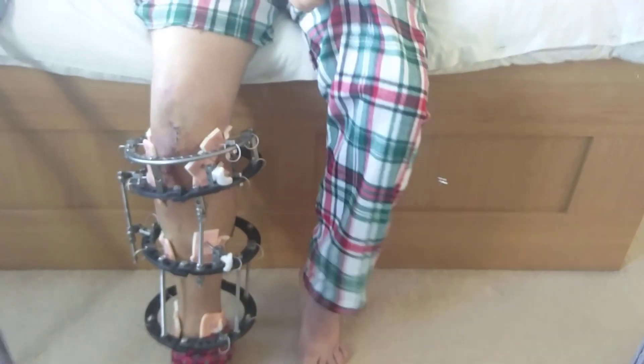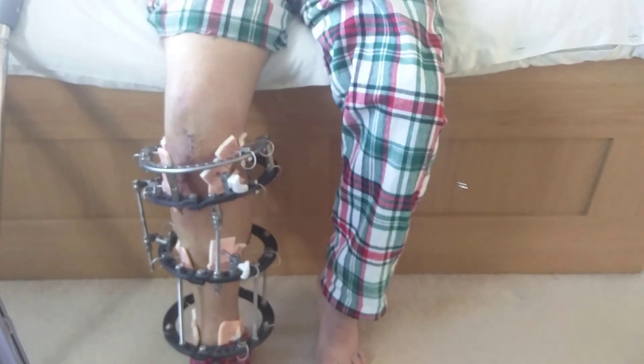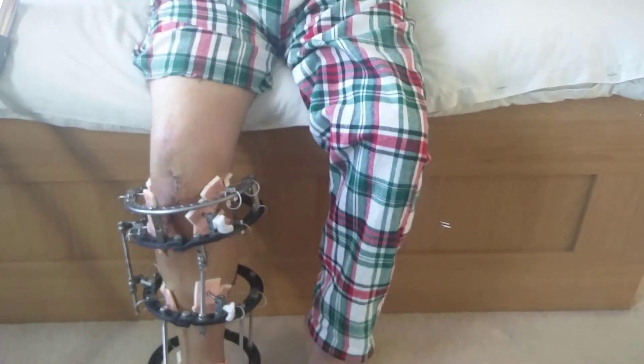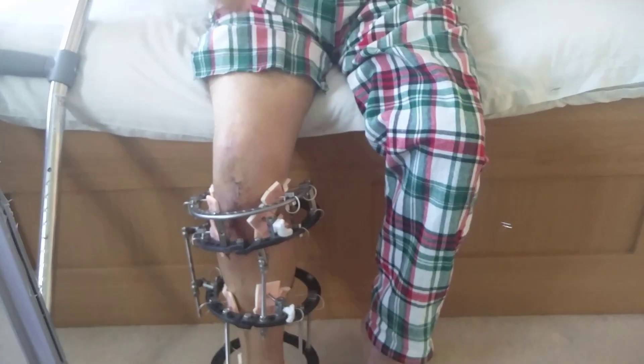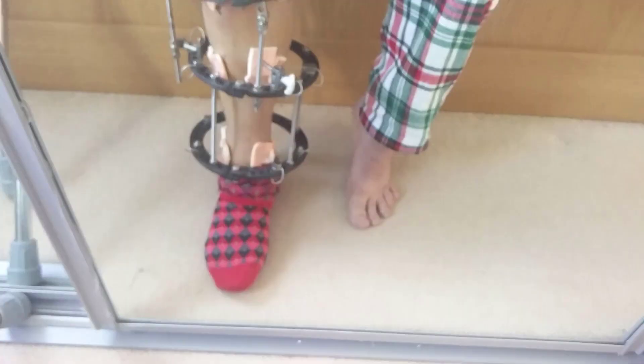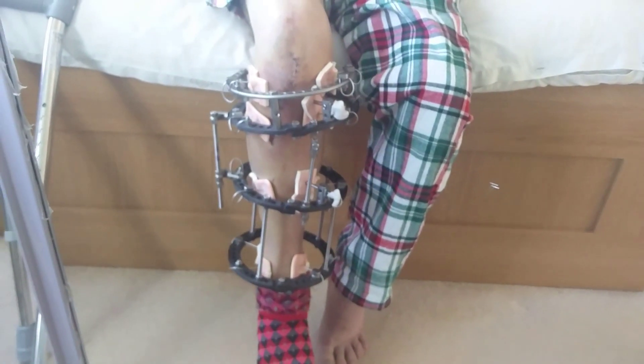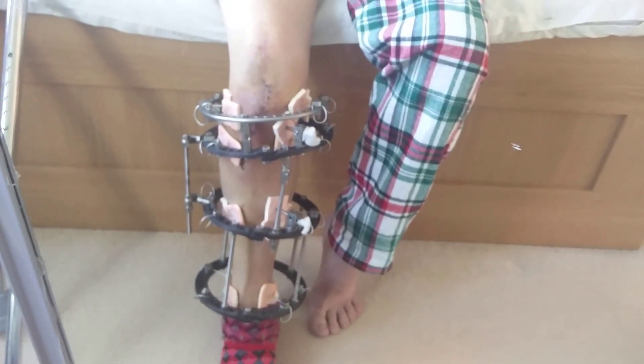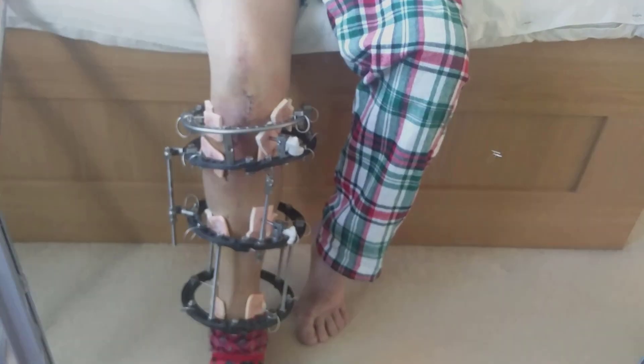Here's my leg, this is how it looks right now. Look at my funky trousers — my wife got some pyjama bottoms from the charity shop and cut them down for me. They need to be pretty big to get over my leg. It's looking quite neat. I've already started to do the adjustments. Let's have a look at the progress over the last week.